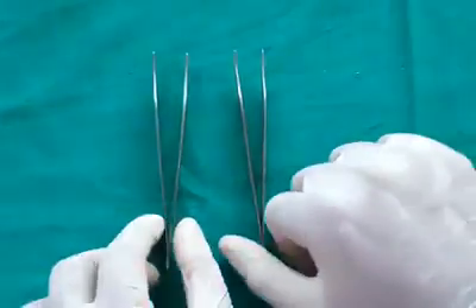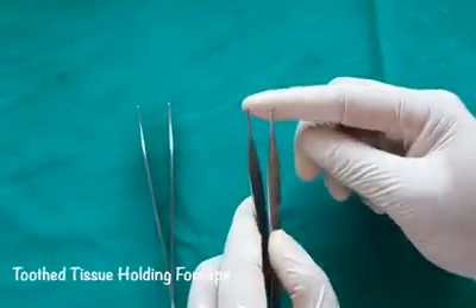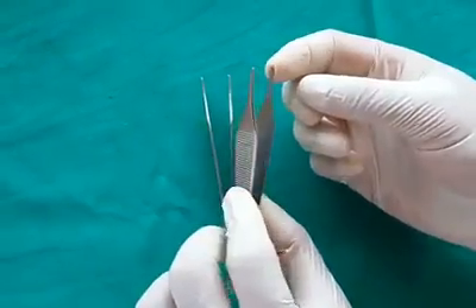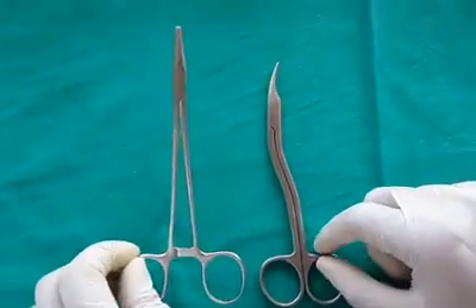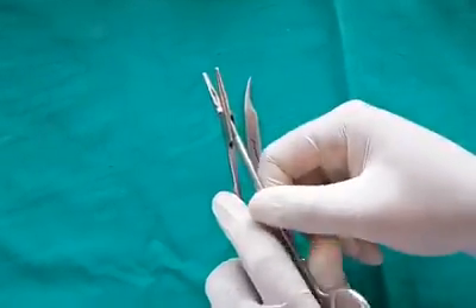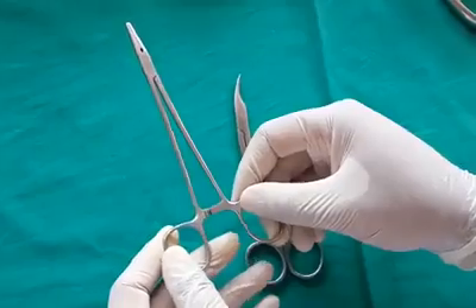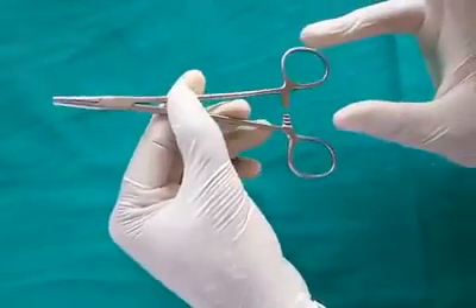Tissue holding forceps are used to grasp tissue during minor oral surgeries and suturing. They come in two variants: tooth tissue holding forceps and non-tooth tissue holding forceps, used for holding delicate tissues. Suturing instruments consist of a needle holder and scissors. The needle holder is identified by criss-cross striations on the inside; it is a latched instrument held with the thumb and ring finger, with the middle finger for support and the forefinger for direction.